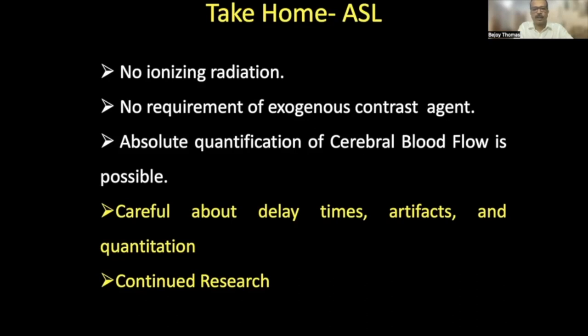Absolute quantification of cerebral blood flow is possible with caveats, because it can be affected by proximal arterial stenosis, increased intracranial pressure, or metabolic changes, but this can be alleviated to a certain extent if you are using multi-delay ASL.